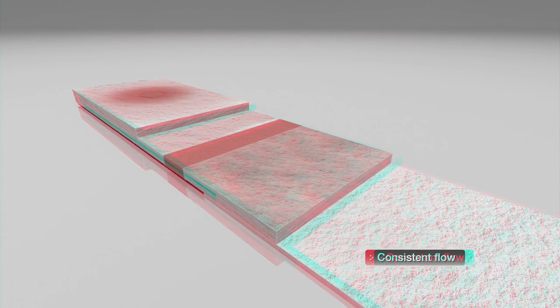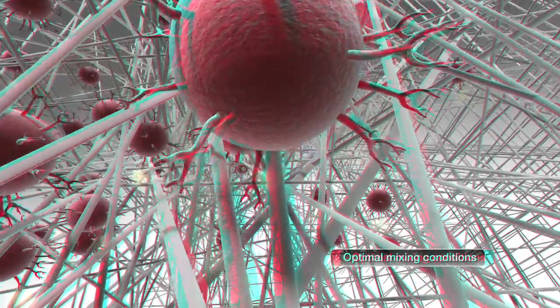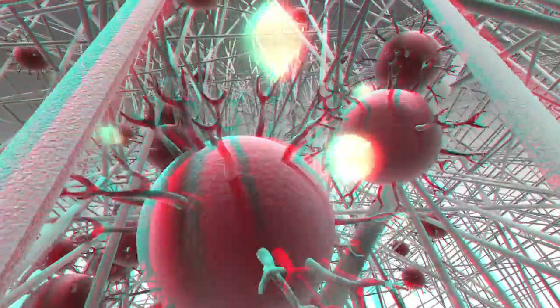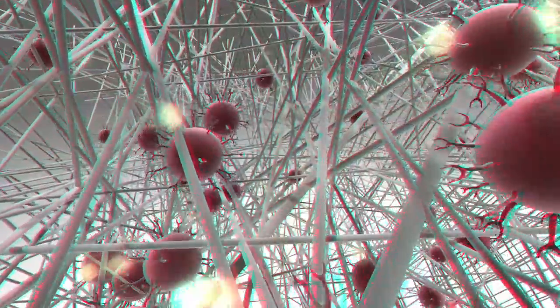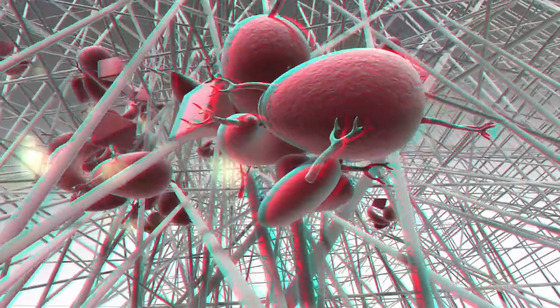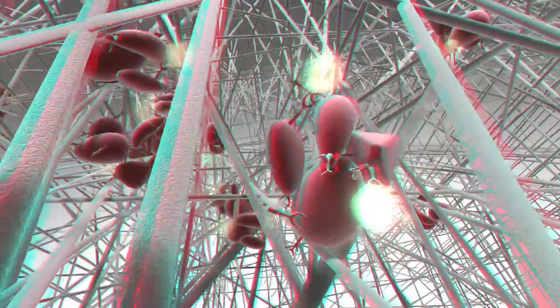The monodisperse gold flows easily and consistently. The antigens within the blood attach evenly to the antibodies preloaded on the gold conjugate, ensuring optimum mixing conditions of the sample and the gold as it journeys through the membrane. Poor quality gold can cluster and become trapped in the membrane.